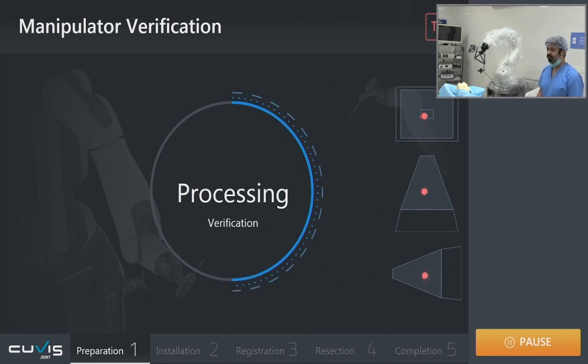And this just takes a few minutes. If I were to find out how much time it takes, maybe a minute or two, not more than that. However, as I said earlier, this is all unsterile. This can all be done before the surgeon comes in, while the patient anesthesia is in progress. That's the time this whole thing can be done.